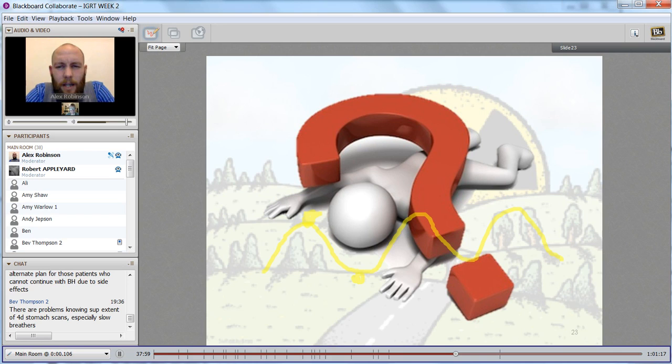Now, essentially, as Rob said, if your X-ray tube is rotating around at the same rate at which the tumour is moving, you get what looks like a slow breath or a slow CT scan. That's where they used to just slow the X-ray tube rotation down, and you'd get this artifact.